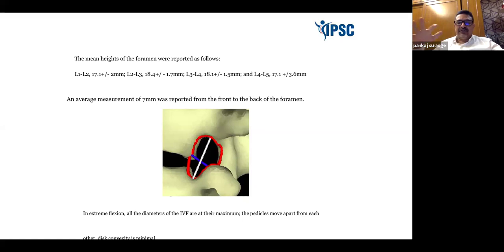The patient is in prone position, the C-arm is in AP position, and we are going from the posterolateral areas. So that will push the retroperitoneal structures posteriorly, and there are chances of entering into the retroperitoneal structures. That is why we should keep our abdomen free.